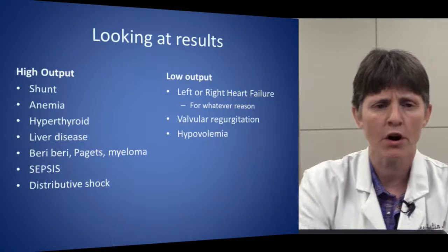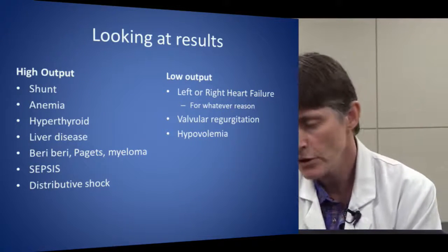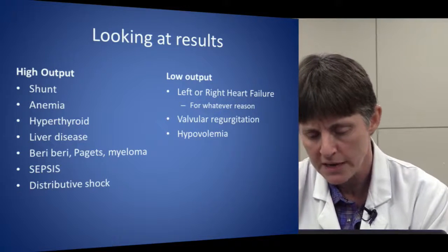That talks about TR. So when we look at our results, we're going to say, wow, we got our pressures, and we're going to use that to help us make a diagnosis.